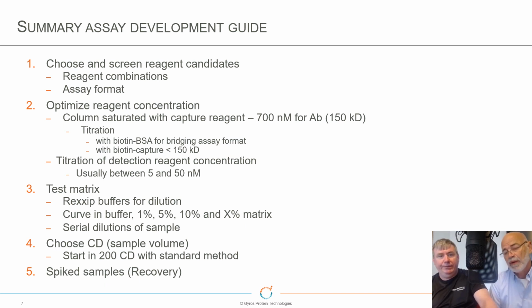Maybe for a different podcast, it would be interesting to talk to somebody who has really implemented a DOE, using more advanced statistical methods to optimize quickly based on 2 or 3 different parameters simultaneously. A multifactorial design of experiments is possible. Yeah, the Gyrolab can be easily combined with the DOE up front to design the experiment.